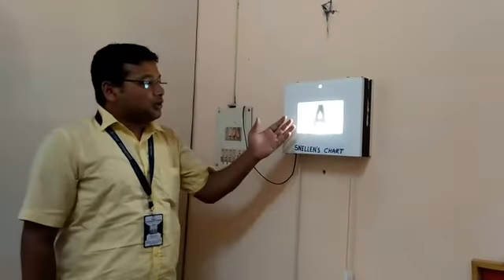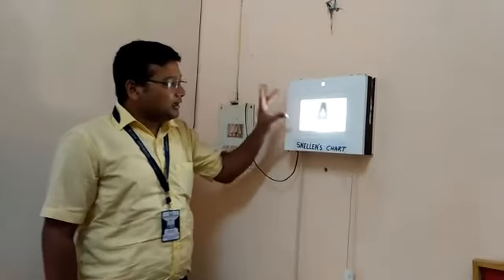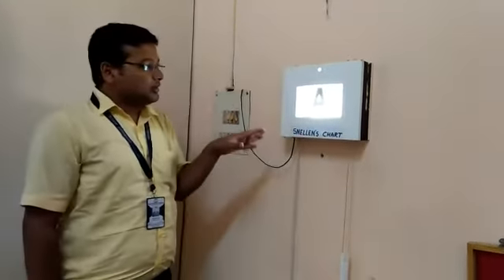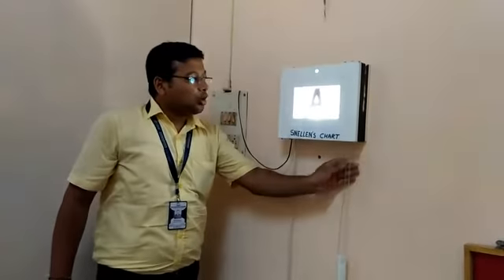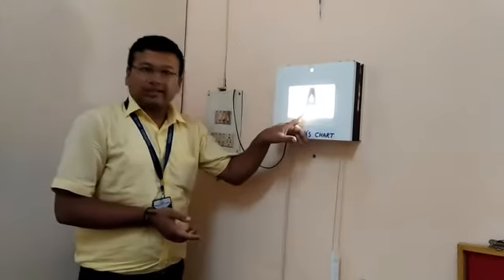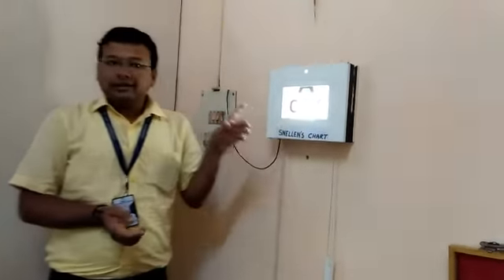So first ask the patient to cover one eye, then ask the patient to read from the top of the chart. It is A in this chart, and this chart is known as the Snellen distance visual acuity chart. And always ask the patient to read from left to right. Say if the patient can read the top letter from 6 meter distance, then his or her visual acuity is recorded as 6/60.